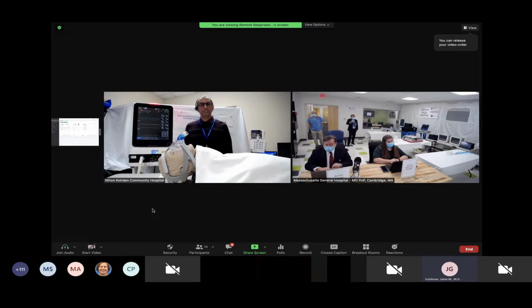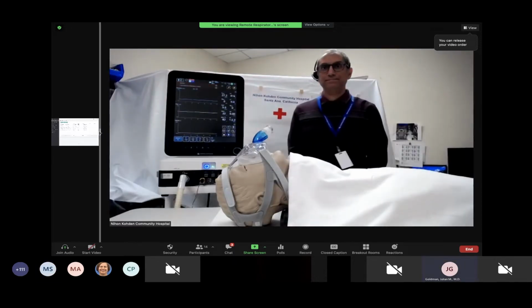I'm here, and next to me is a respiratory therapist, Alyssa. If you press the button that allows us remote access to your ventilator, we'll take a look at the data and see how we might be able to help. I will do that right away. All right. Done. All right, thank you.